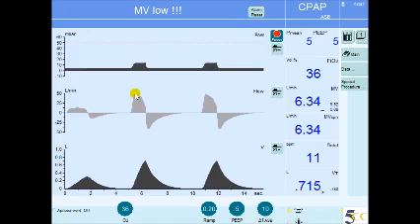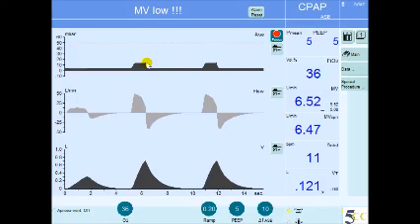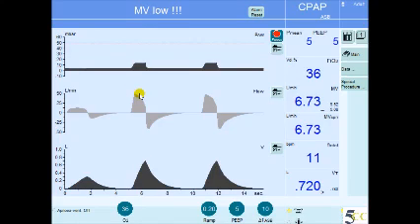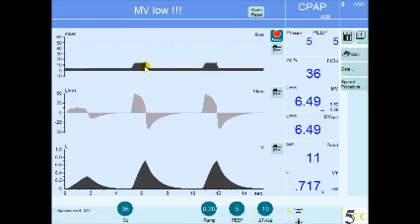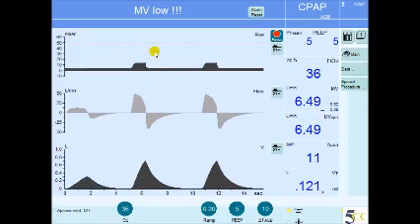The machine monitors the decelerating limb of the flow wave, and once it reaches a certain value set by the operator, it will cycle — meaning it will end inspiration and release that pressure. In this breath, it's about 25% of the maximum inspiratory flow. Once this value is reached, the pressure is released and the patient exhales. So the three variables for the breath are: the trigger (flow, which is patient-triggered), the limit (pressure at 10 centimeters of water), and the cycle (25% of the maximum inspiratory flow).